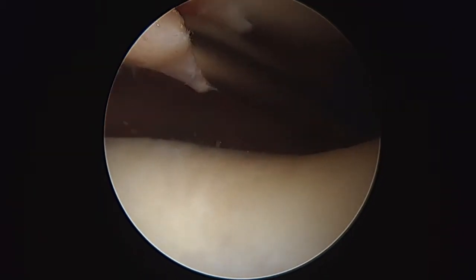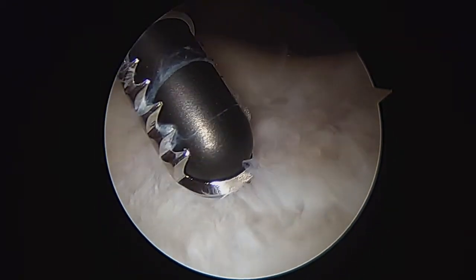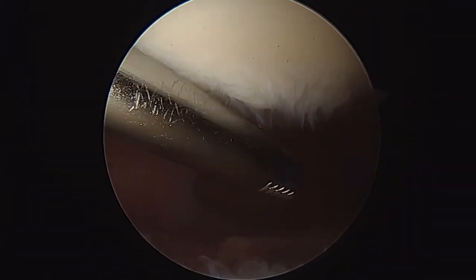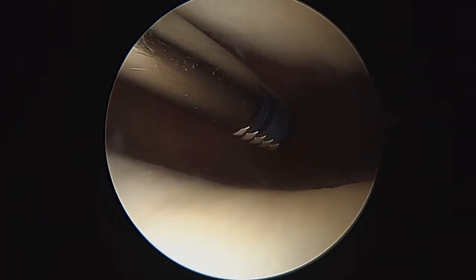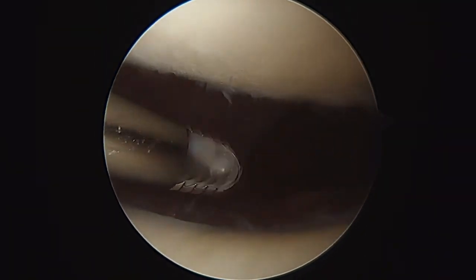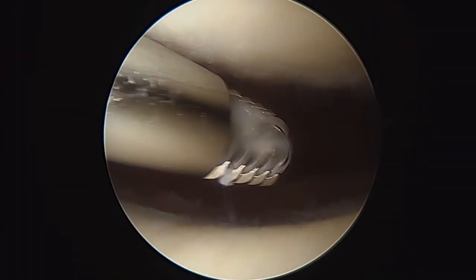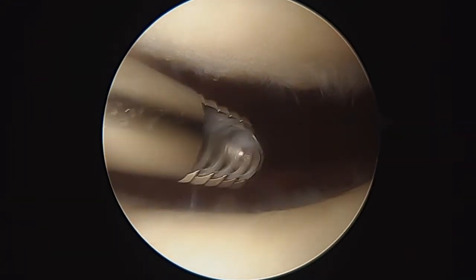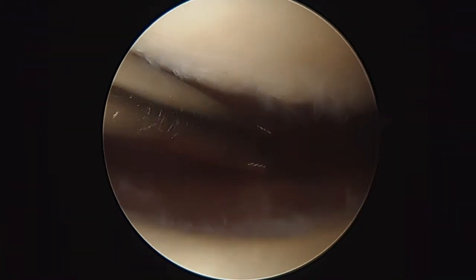Okay, so we're all done here. We've cleaned up the edges and made them as stable as we can without taking away any of the healthy cartilage. We're going to count on our injection to help with the rest of that. Now we're just making sure there's no more loose pieces floating around with our suction — and that looks really good. So we're going to finish up here. We'll get you back to the recovery room shortly. Good luck to you now, bye-bye.